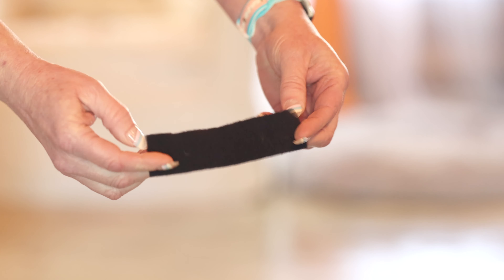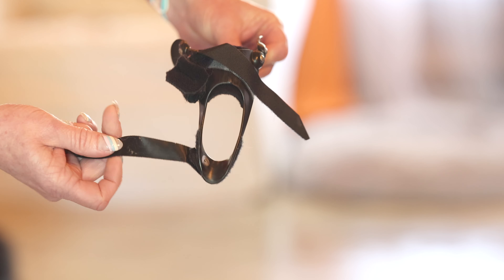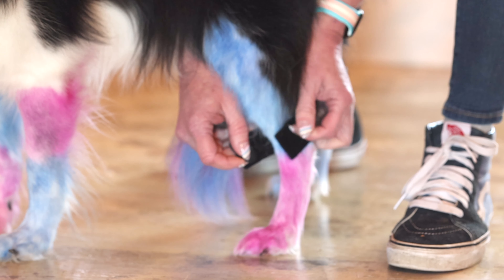Hey, you want to wear your knee brace? This is the Hero Knee or Stifle Brace. This is the top, bottom, front, and back. There are two straps and a thigh cuff. There's also a piece of neoprene that will protect the hock.